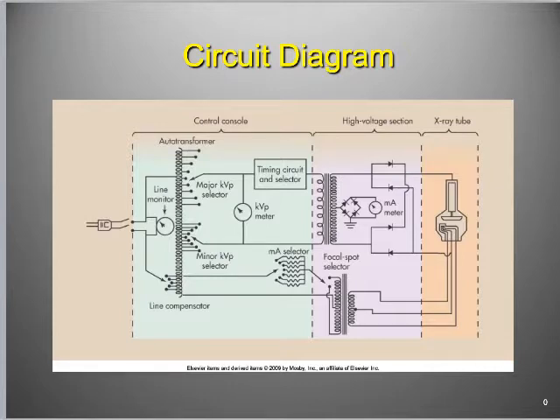So the very first thing that we've got is a power source. Literally this thing plugs into the wall somewhere, right? Much like your washer or dryer or microwave at home. So that's this little doodad here indicating it's plugged into the wall.